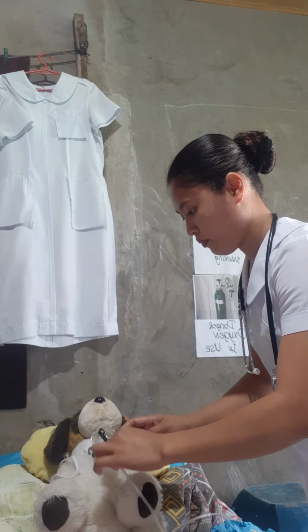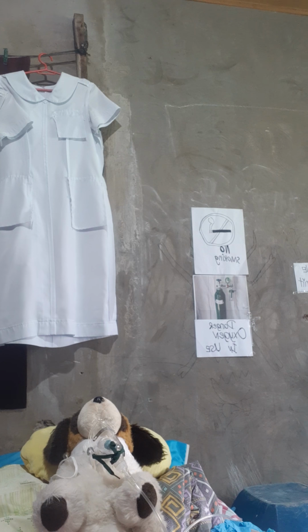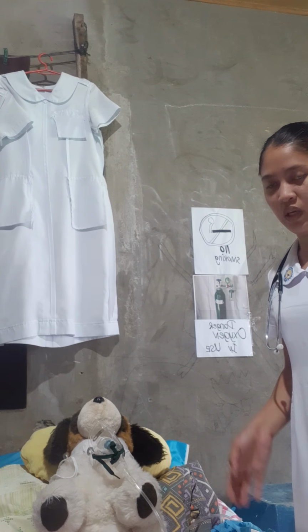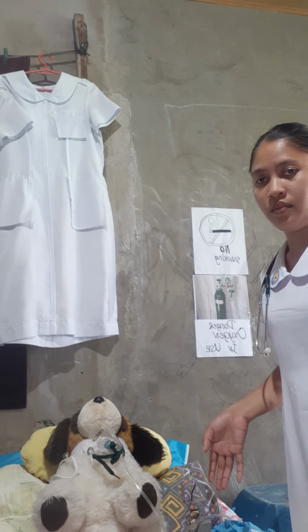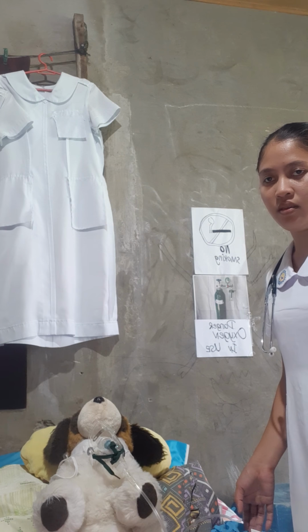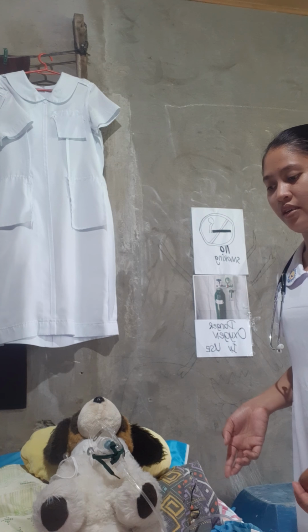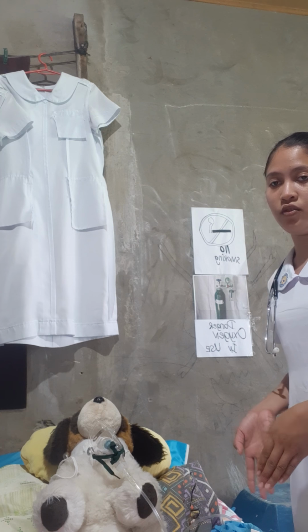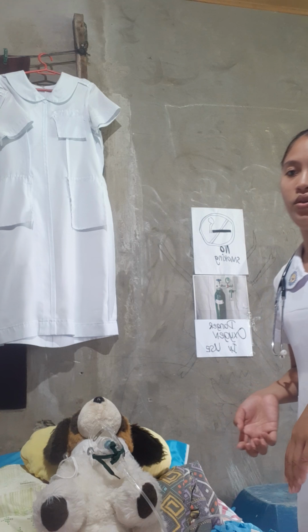Afterwards, we are going to place my equipment at the bedside of the patient, and place a proper receptacle within reach in my working area, so that it will save time and effort for me during the procedure.